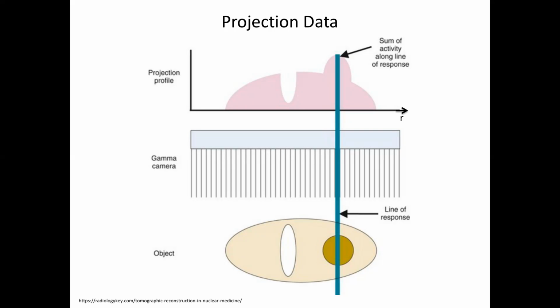So we're going to do a little review on how a function like this is used to make a two-dimensional picture from these 1D projections, right? In some ways, I guess it's common sense that you should be able to do this. For very trivial examples, you can see how it works.